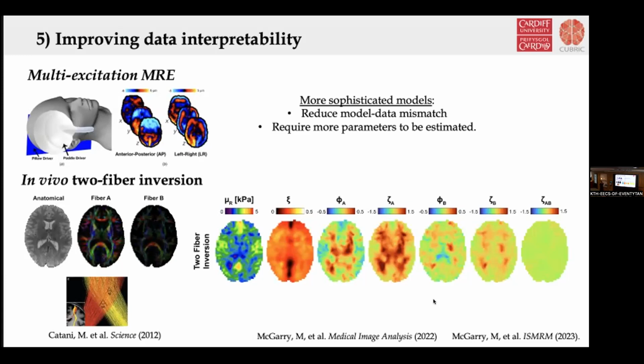During my PhD, I assembled 3 different MRE protocols that were used worldwide. I performed phantom experiments and brain experiments, and was very much swayed by my results on a particular pipeline. I haven't shown this data, but it was a Cirrus phantom with 4 stiffness inclusions, and the multi-band approach had very good accuracy.